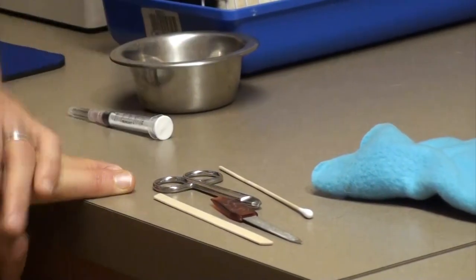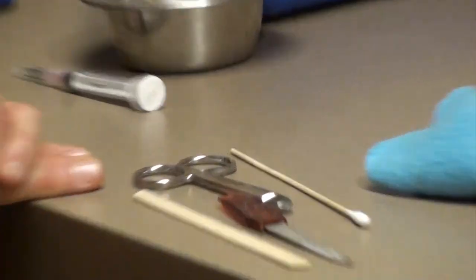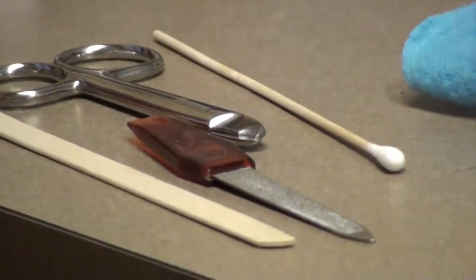Like with most other procedures, the most important thing is that somebody can hold the animal still and that you can work quickly and efficiently to get the teeth trimmed.